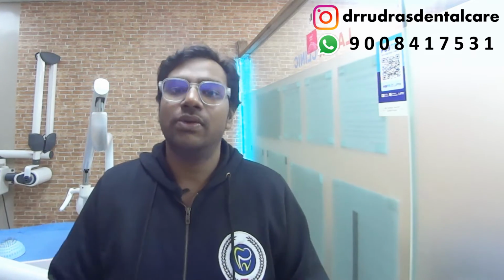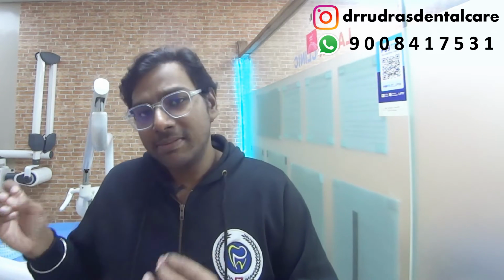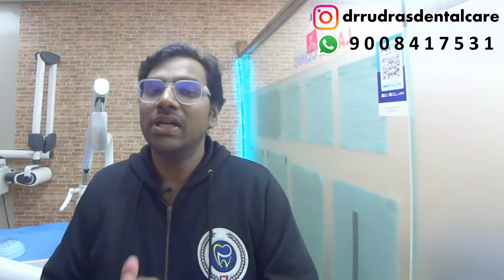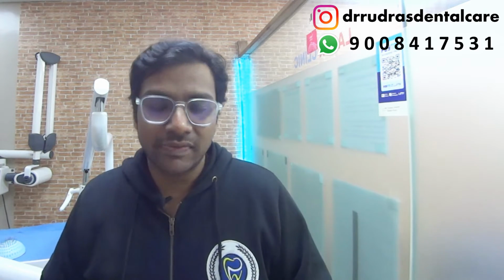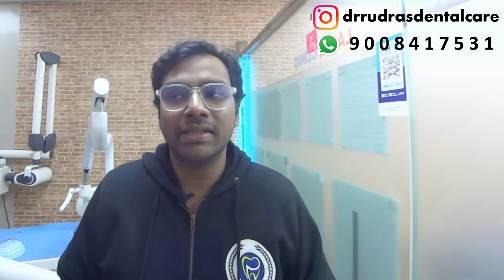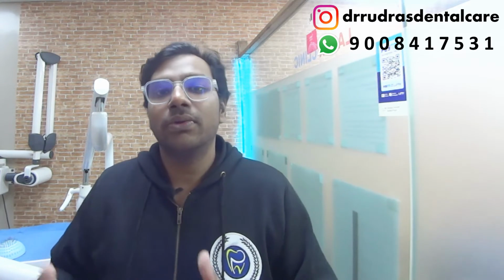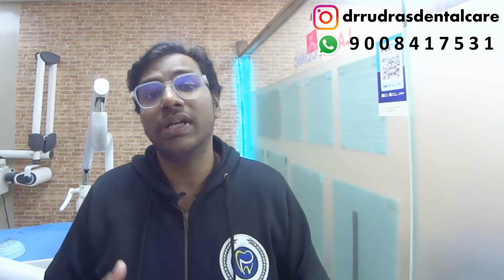Now, I have to be very honest, if you have severe obstructive sleep apnea, it is always better for you to go to a sleep specialist, and if they are highly recommending you go for a CPAP or a BiPAP machine, please do not try to argue with the sleep specialist, because they know what's in the best interest for you, and try to get your hands on this CPAP or the BiPAP machine. Now, I understand that they are very expensive and very bulky and they cause a lot of side effects, including discomfort while you're getting acclimatized to the machine. But the same things also go for the mandibular advancement device, because it usually takes about 6 to 10 weeks for you to get acclimatized.